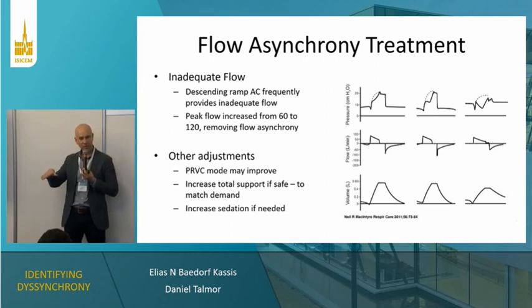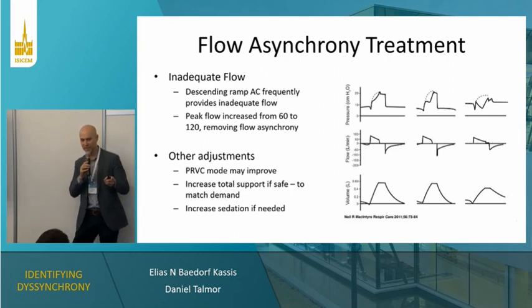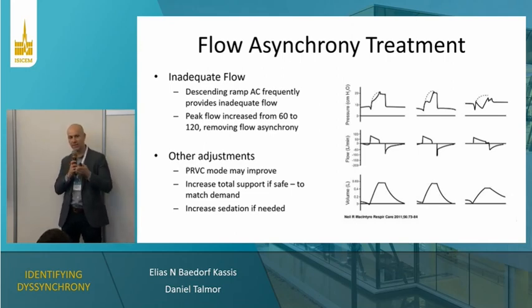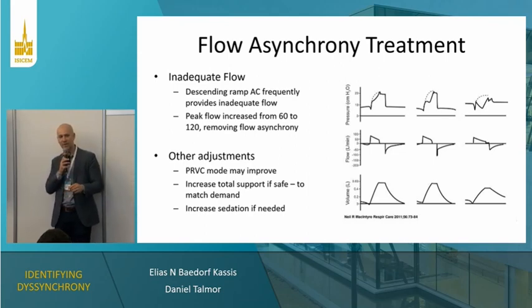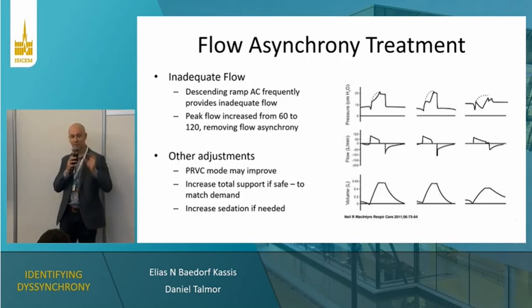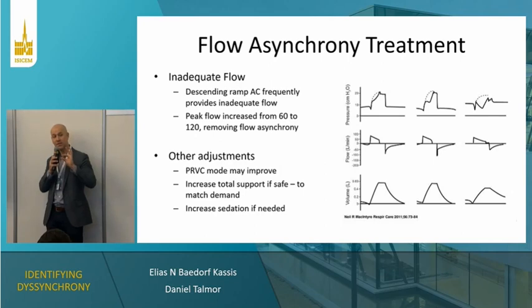If I actually showed you the waveforms for it, it wouldn't be as impressively bad as you might expect, though. The reason is that if the patient is having a big inspiratory effort, the airway pressure is often going to be sucked down as well. And recall that the transpulmonary pressure is the airway pressure minus the pleural pressure.